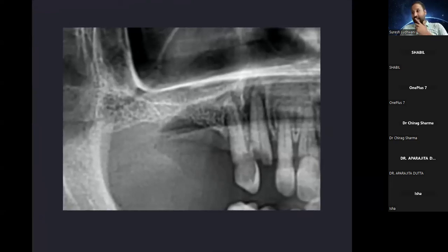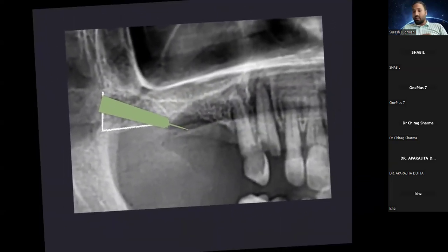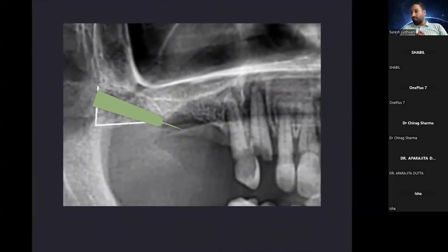I personally like to zoom in, because that gives me detailing in case I'm missing any vital structure. This is what I have planned, and I see one or two people who are very closely aligned with my planning. Am I wrong or are you right?